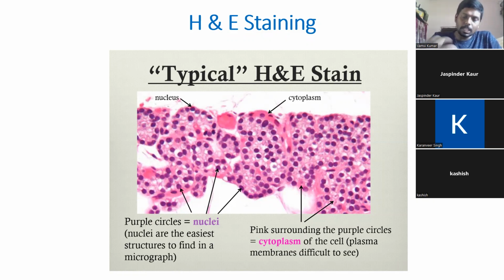Let us take another example. We know that cells have receptors, all receptors are antigens, and I cannot target any antigen in this particular tissue. The reason is that all antigens are proteins, and the proteins are already destroyed. If that is the case, how can I know in what part of this tissue my desired antigen is located? That is not at all possible by histopathology. Then, is there any other way to detect, localize or pinpoint the desired antigen in this particular tissue?